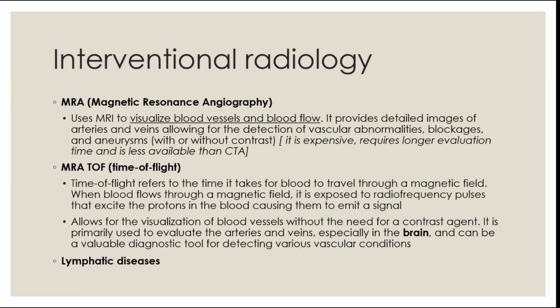And when the blood flows through the magnetic field, it will be exposed to radio frequency, and also the protons in the blood. It's the same concept, instead of water, it's for the blood. So you are visualizing the blood vessel itself without the need for the contrast. And this is really useful, especially in the brain tissue.